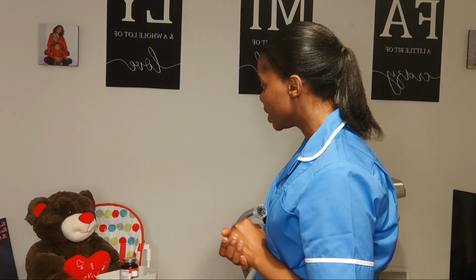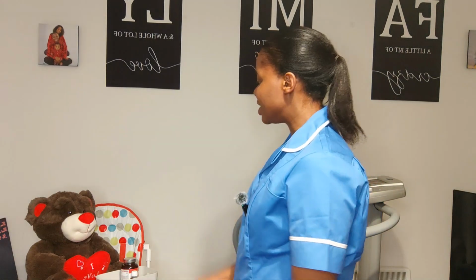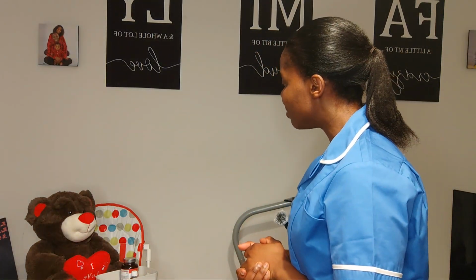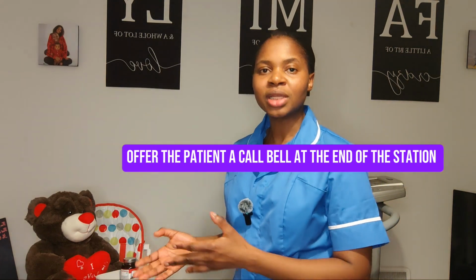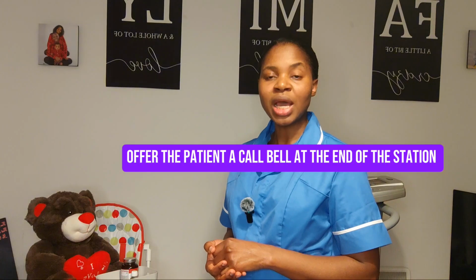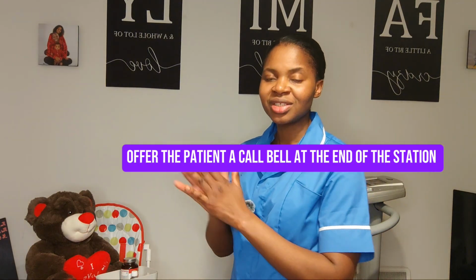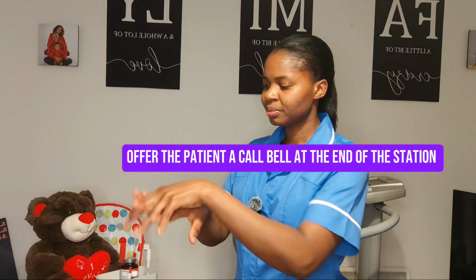Is that okay? So I'm going to be stepping aside now to quickly document what I've done, and I'll be back shortly. Is that okay? All right, I'm back. Are you still comfortable? All right. Thank you so much for your time, and I will see you some other time. Thank you. So I'll go ahead now and clean my equipment, prepare it for the next use, and perform my final hand hygiene according to the 7 steps of WHO standard.